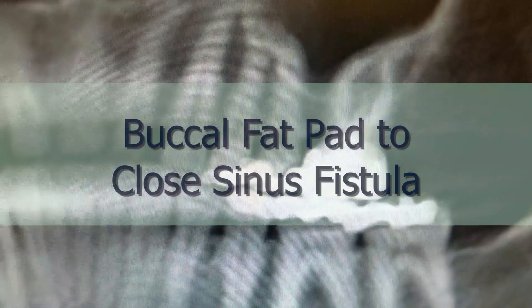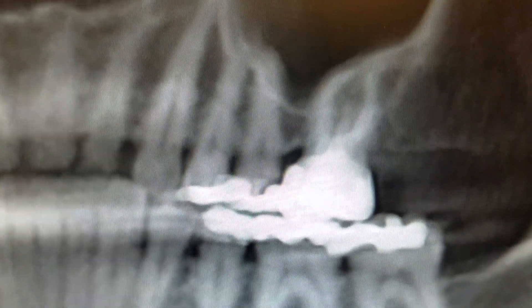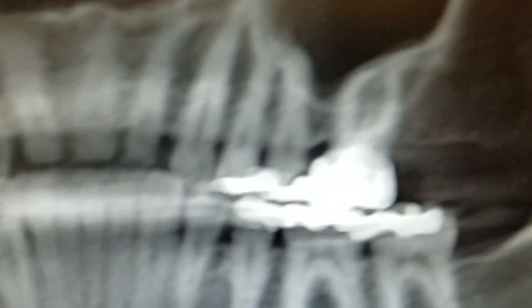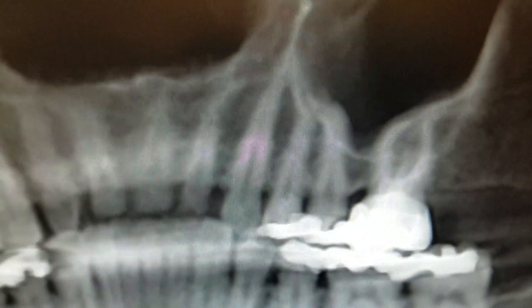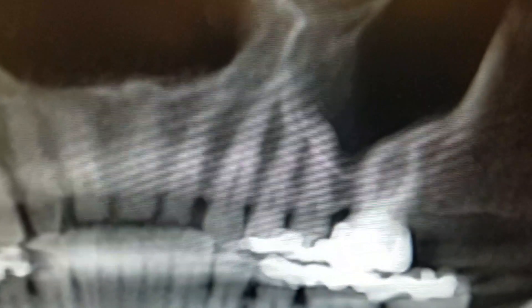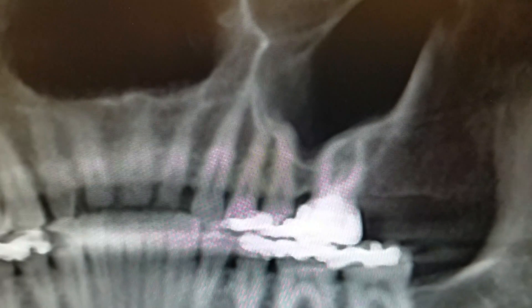Welcome to this week's episode. I'm going to show you on this gentleman tooth number 14. Tooth number 14 was removed — not by me, by someone else — but there was an oral-antral communication afterwards, which I could totally see happening regardless of the surgeon.